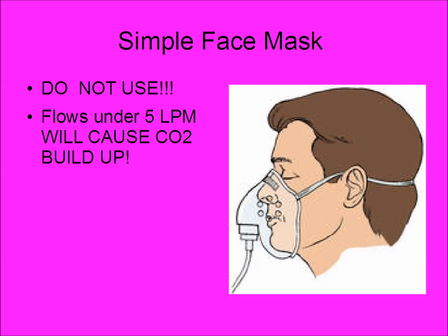The simple face mask, simply all I can say about it is do not use it. It cannot support flows below 5 liters per minute. If you put a patient on a simple face mask, say at 4 liters per minute, really they're going to get more CO2 than oxygen, and CO2 is a bad thing when you have more of it than oxygen or out of proportion.